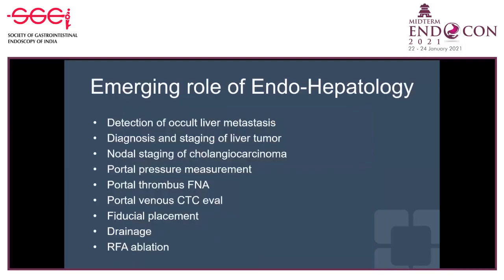So as I mentioned, there is an emerging role of endohepatology, and we use endoscopic ultrasound at our institution and across the world where the expertise is available routinely for detection and diagnosis of occult liver metastases. Again, a significant amount of data shows endoscopic ultrasound is superior to CT scan in detecting smaller metastases, for example 5 millimeters or smaller. We use this routinely for diagnosing and staging the liver tumor.